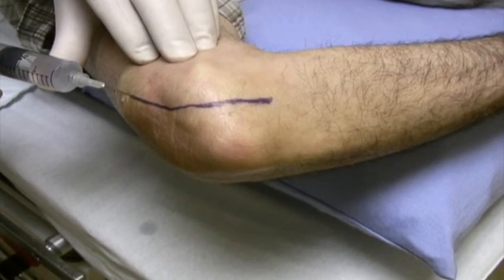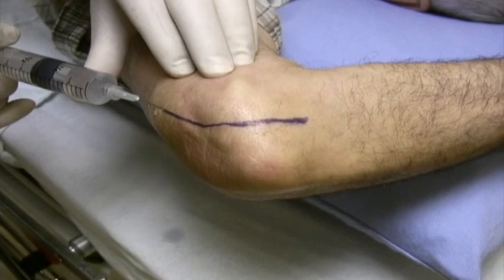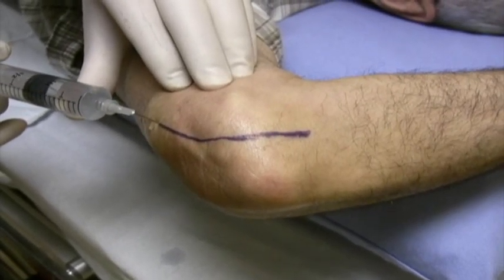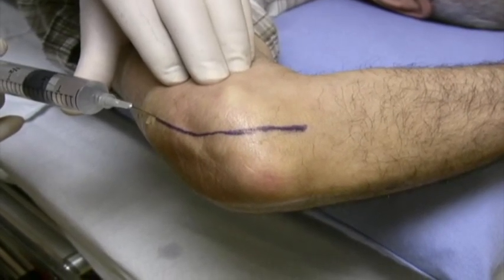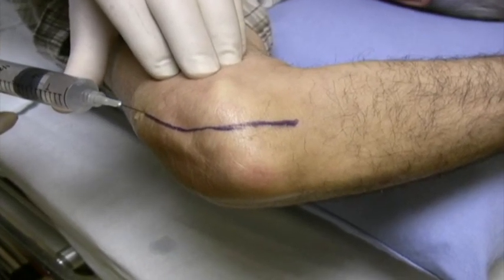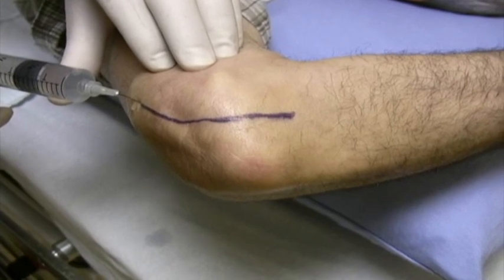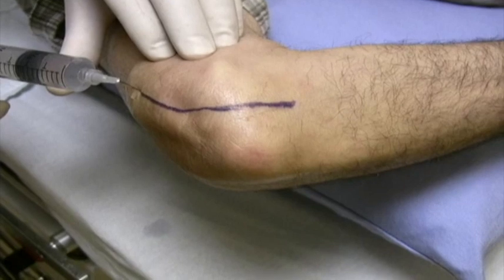And it shouldn't be bad because it's a 27 gauge needle. Yeah. So it's a pretty small needle. You know, it's a sharp point. A sharp point, pretty small needle. The big issue here, or the big important point, is big volume. Big volume, lots of time, no rush, and blow slow before you go.